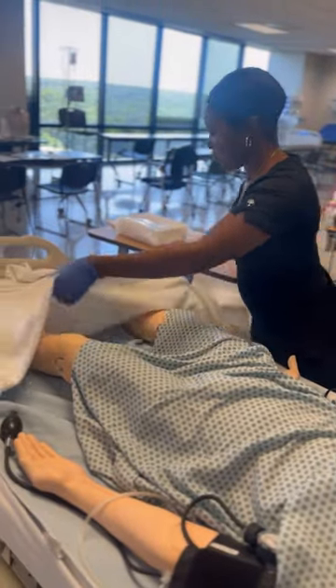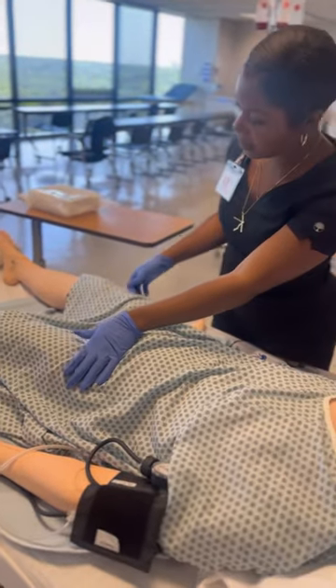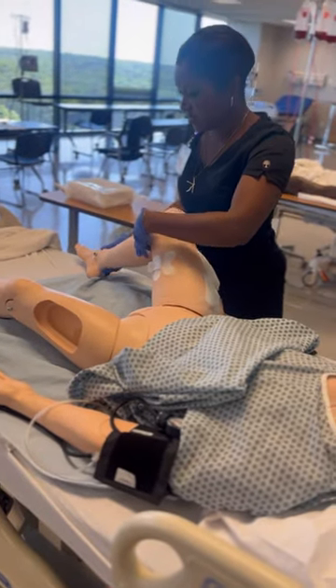Ensure that your patient is positioned properly. The position of the patient should be dorsal recumbent, meaning that the knees are up and bent, feet are about two feet apart, and the legs are abducted.